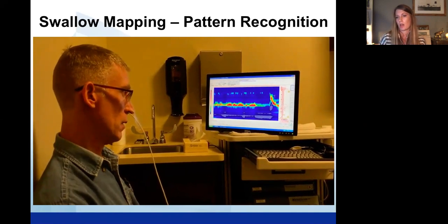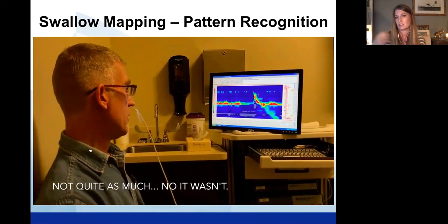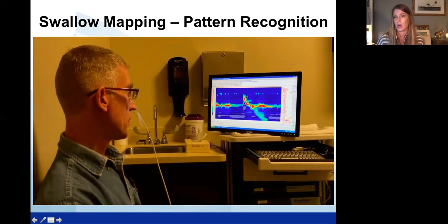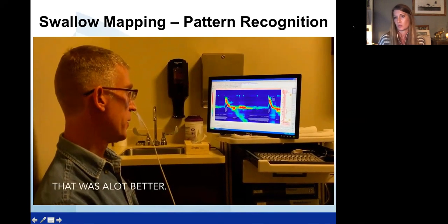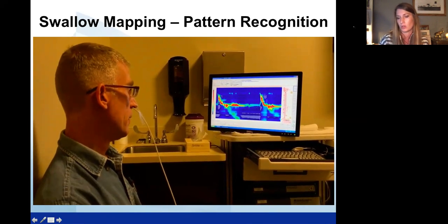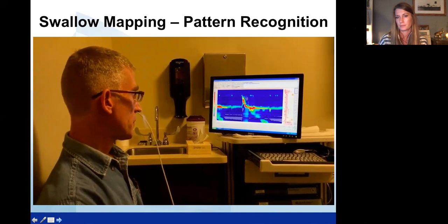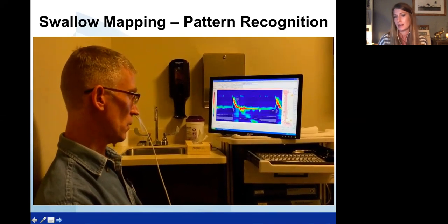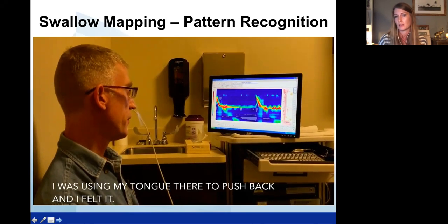The patient is swallowing, he's getting that kinesthetic proprioceptive biofeedback, and then he's describing what he's feeling and what he's doing to help manipulate and change what he's seeing on the screen to meet our visual targets that patients will all learn and be oriented to on their first session. And again, you see he's not in any pain. The catheter is placed, it's taped to his nose. It's relatively comfortable and easygoing.